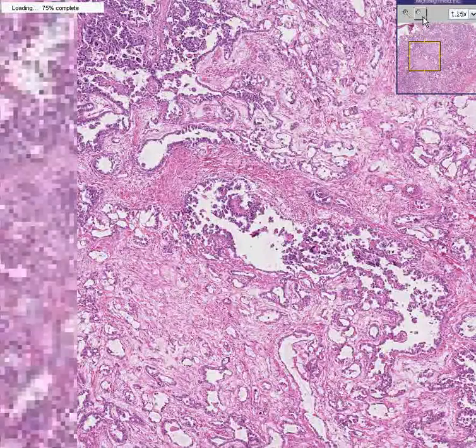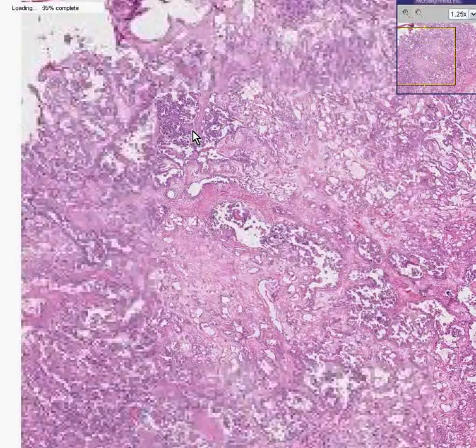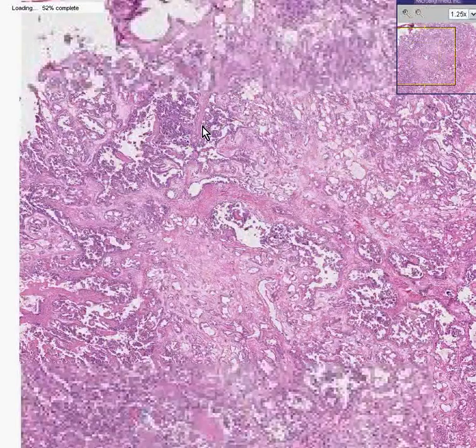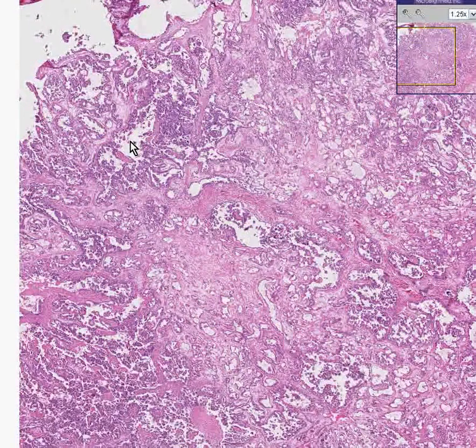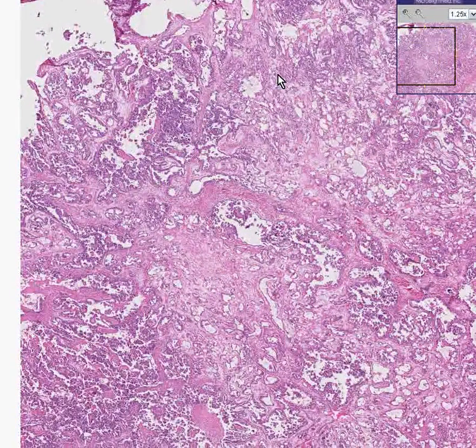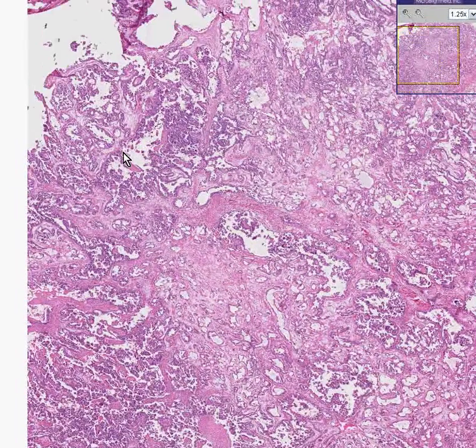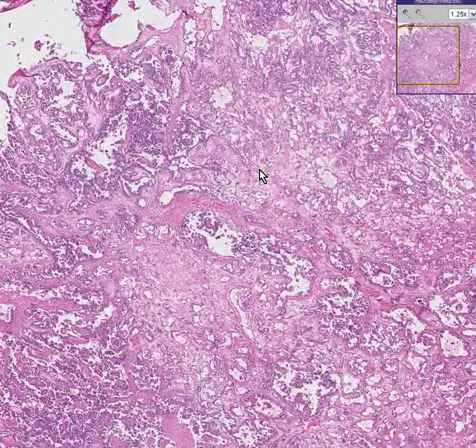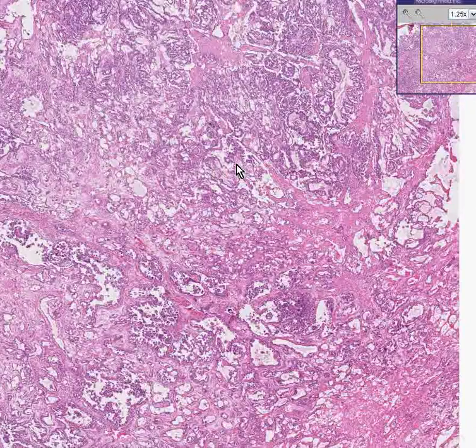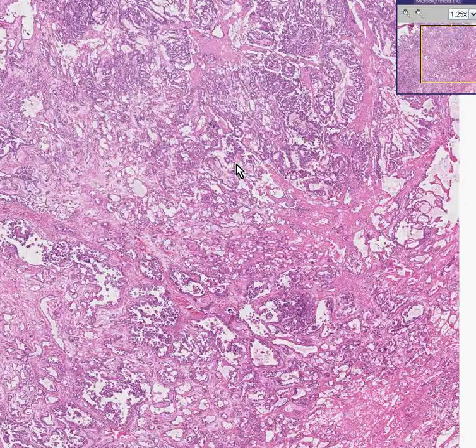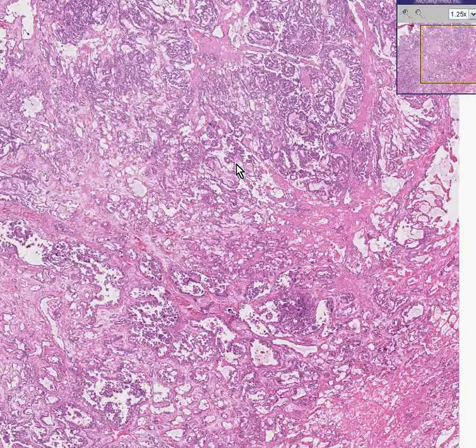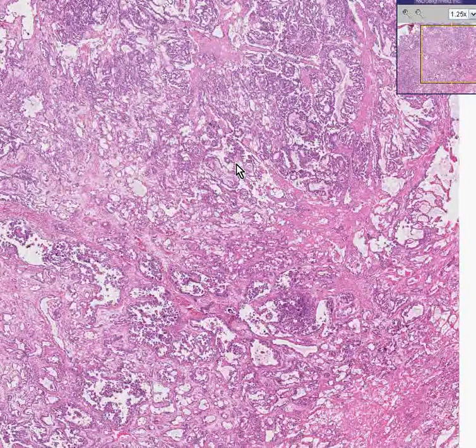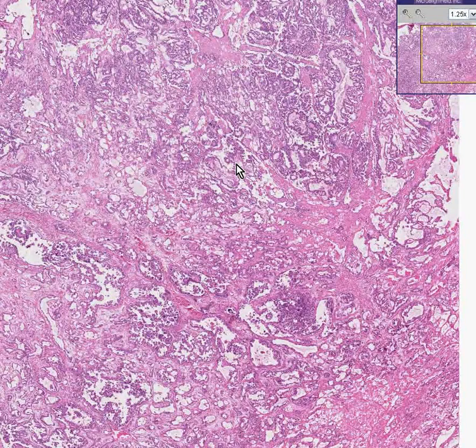We could notice the fact that there is nothing left on this slide that looks like normal testis. All embryonal carcinomas are malignant, and they all behave the way any other primary malignancy of the testis would behave, with metastases not to the inguinal lymph nodes, but to the periaortic lymph nodes.